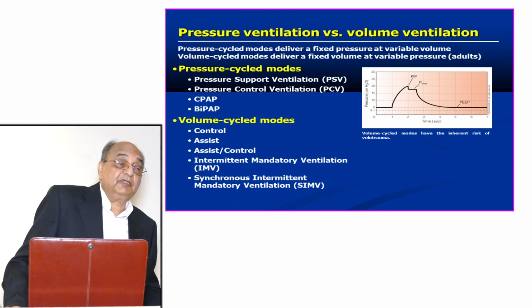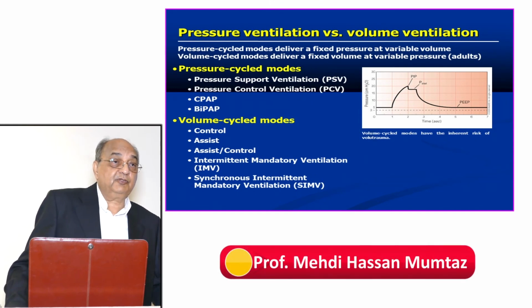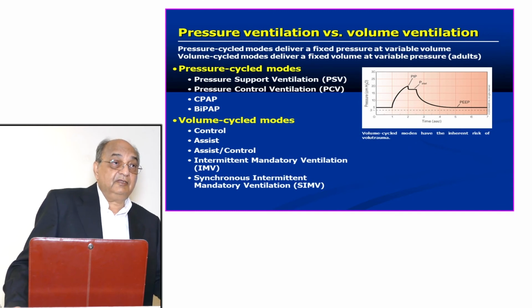As soon as we put the patient on the ventilator, our objective should be, after correction of the gases, to bring the patient back. It's not a good thing to keep the patient on a ventilator, because always remember, when you put the patient on a ventilator, you immediately give trauma to the lung, because it is an unnatural way of breathing. As I told you, respiration is negative pressure breathing. When it's ventilation, it is positive pressure breathing, which is against the natural way of breathing. Anything which goes against nature is bound to have some complications.